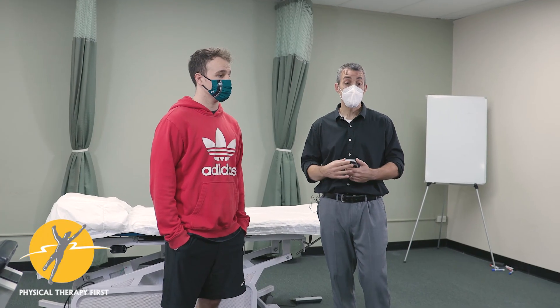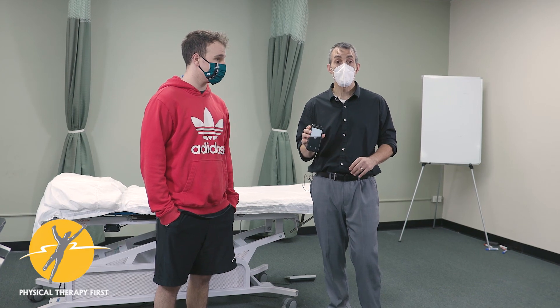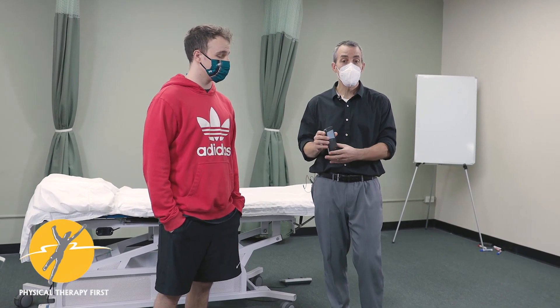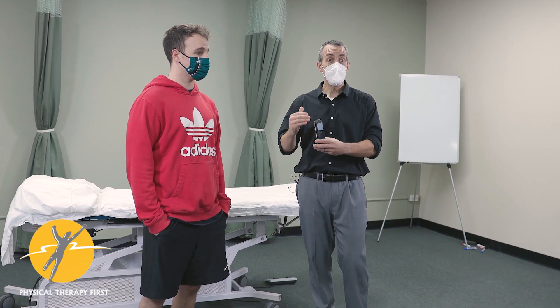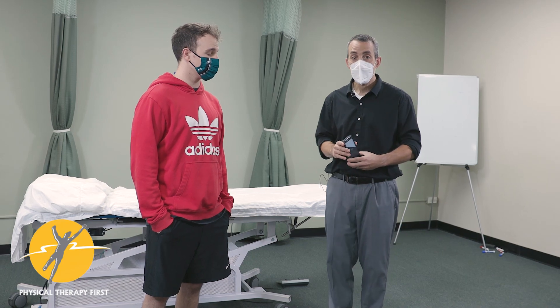There have been some recent studies showing that you can use the inclinometer on the iPhone, or different inclinometers you can purchase, and they have really good validity — equal validity to goniometric measurements of the ankle.